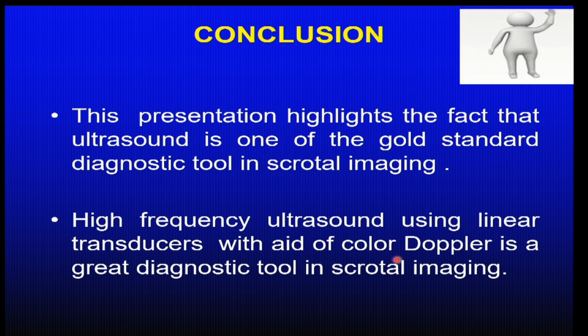I gave you a dictum that start taking volumes of the testes, which is a marker of male infertility. Always, I want to give you an important take home that if you're doing a scrotal ultrasound for male infertility, always make it a habit for the patient to get their semen analysis report. We always have the habit, again, just to look for varicocele. Your approach should not be that way. If you look at the semen analysis report, look at the fructose test.